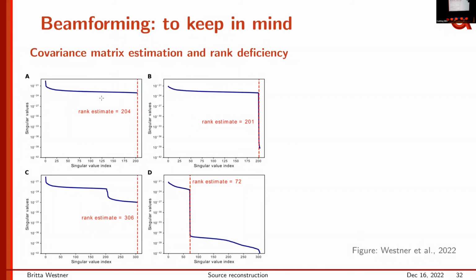And this happened because this data here, I used ICA on, and I kicked out 2 blink components and 1 heartbeat component that got extracted from the data. And even though the data got transformed back into sensor space from this subspace that we used to define our components in, that information is of course still missing from the data.